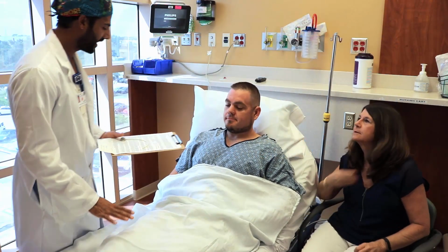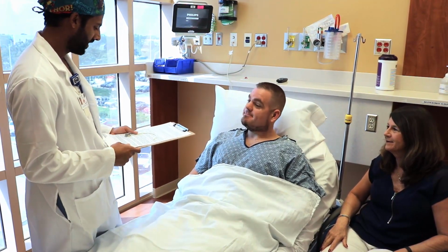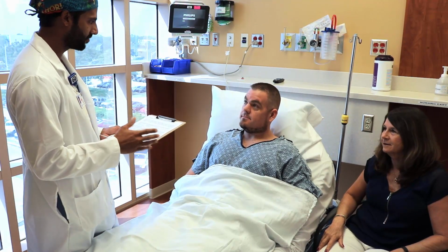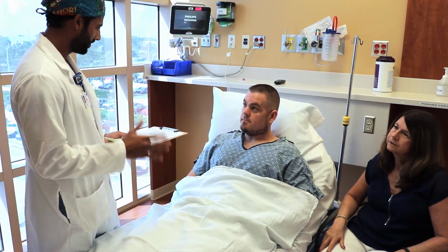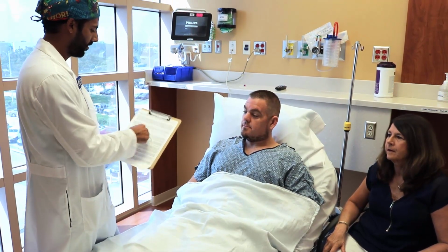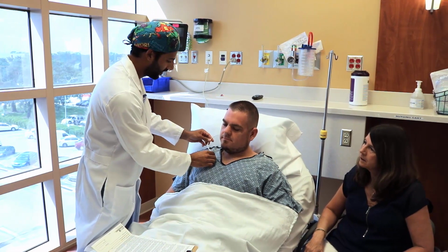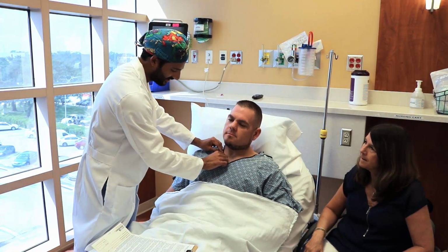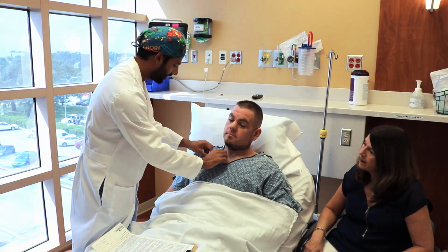So I want to go through today with you what a port is. Have you ever experienced what this is? No, doctor. Okay. So a port goes into your veins so that we can administer drugs, we can do blood draws, all that kind of stuff, and you don't have to get stuck anymore. What we do is we take a port that looks like this, all right? We put this into your chest right here, and it goes up over your clavicle and down into the vein right here. Okay, that's how it's going to sit after we're all done, except of course it's going to be underneath your skin, all right?